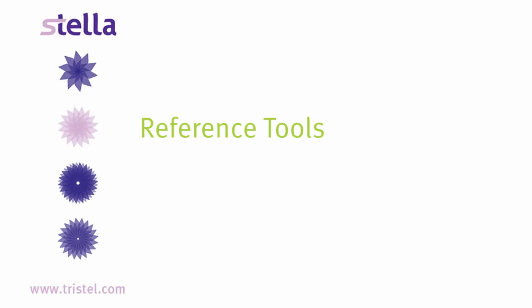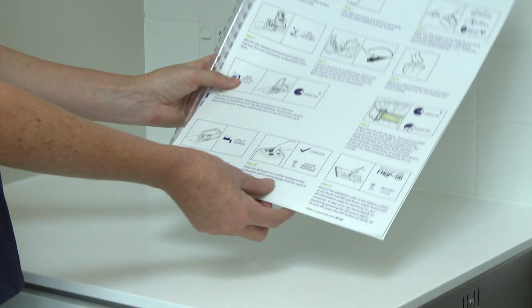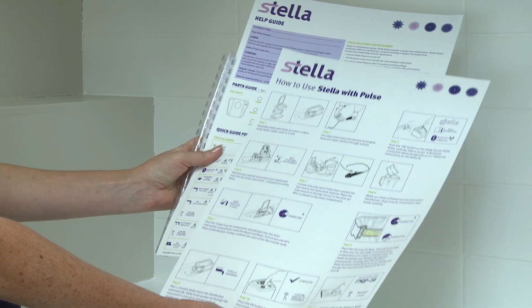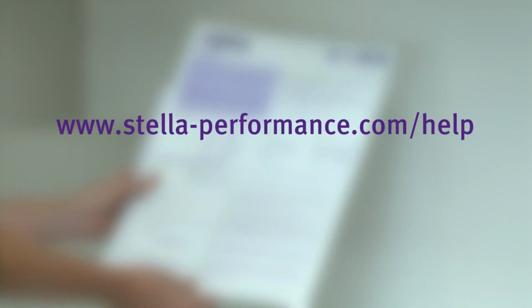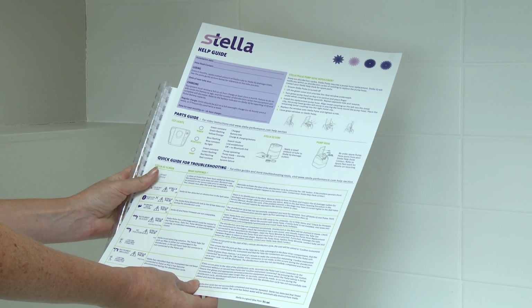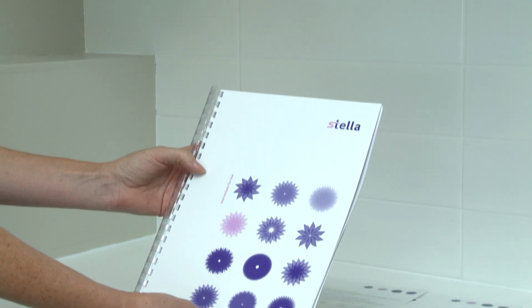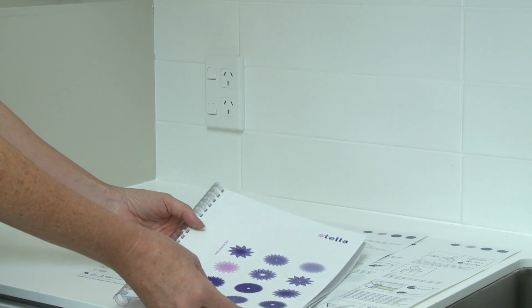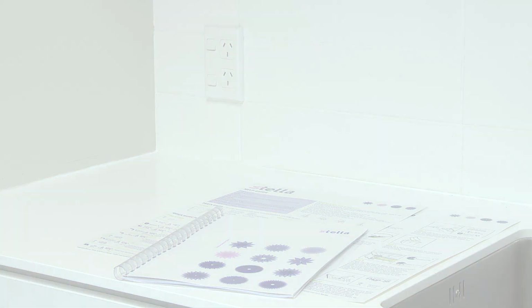Reference tools. Troubleshooting tools to support you with Stella system operation include the Stella Quick Guide Wall Chart for operating instructions, the Stella Help Guide Wall Chart for maintenance and troubleshooting advice, and the Stella Performance website, www.stella-performance.com/help, which offers guides, troubleshooting, and how-to videos. The Stella Instructions for Use manual provides comprehensive information on the system and how to operate. If you are unable to find the information you need in any of these tools, contact your Stella service agent.